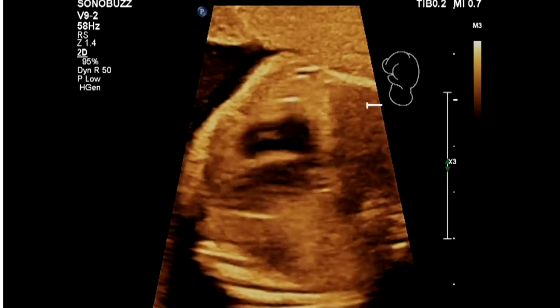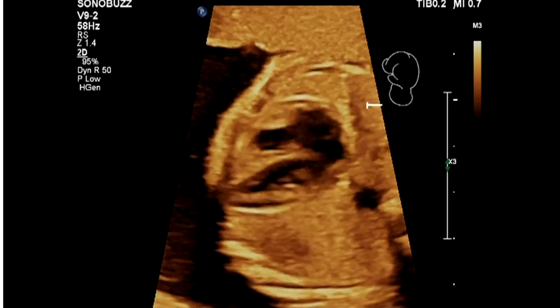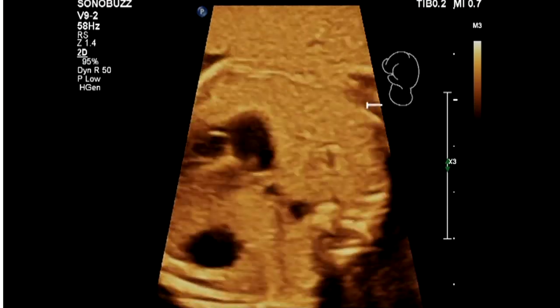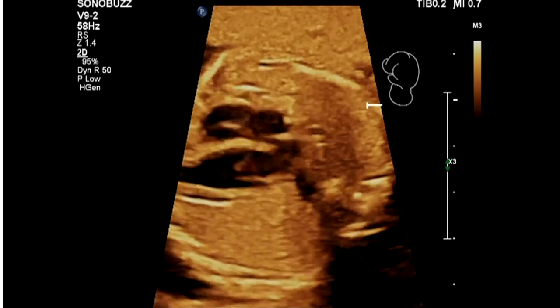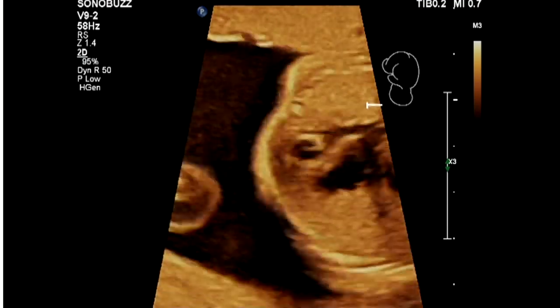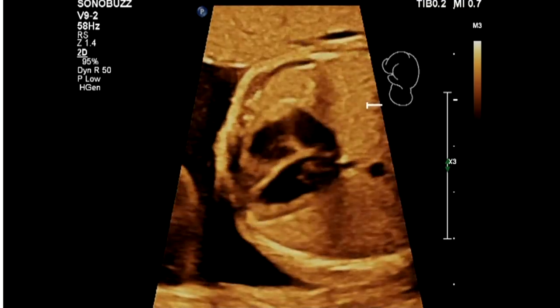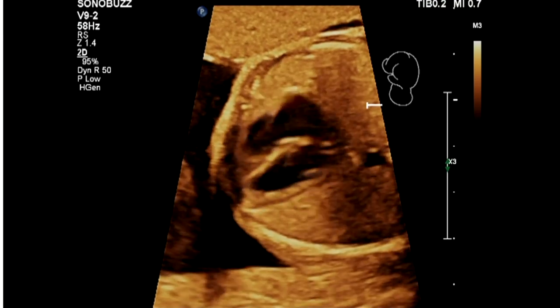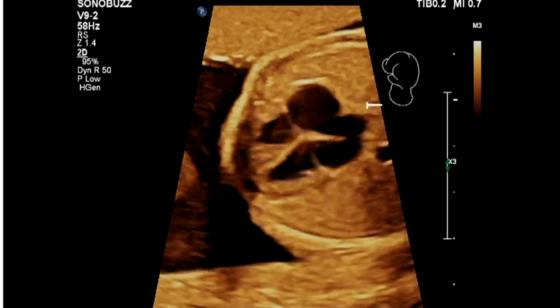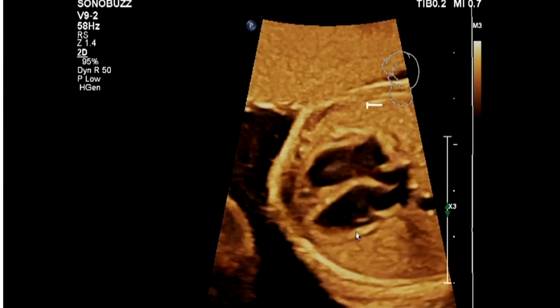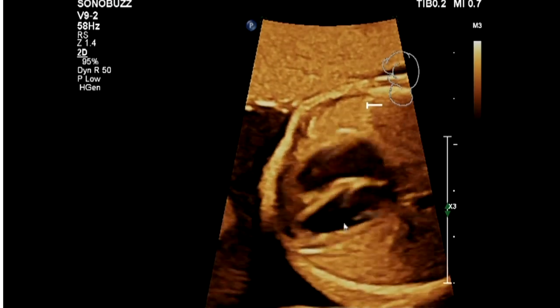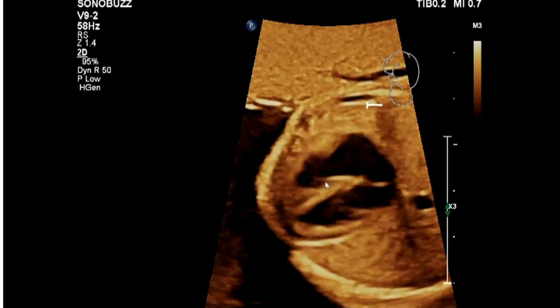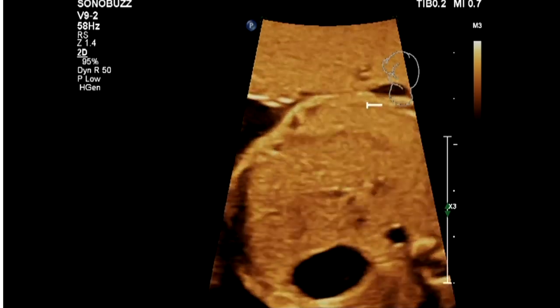We haven't even looked at the outflow tracts yet, but we've looked at the four-chamber view, the mitral and tricuspid valves, the crux of the heart, the inlet septum, the muscular septum, the pulmonary vein, the flap of the foramen ovale, mitral and tricuspid valve regurgitation, and the valves opening. You can see how the mitral valve comes away from the septum and opens up, whereas the tricuspid valve comes straight towards the apex with attachments on the septum.